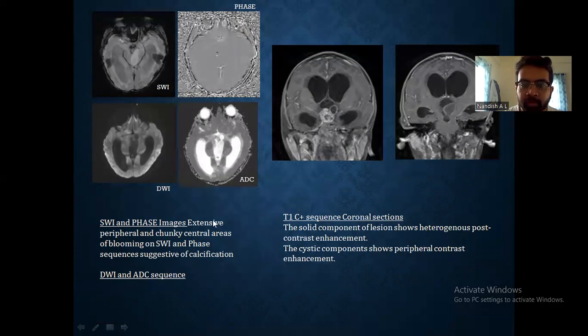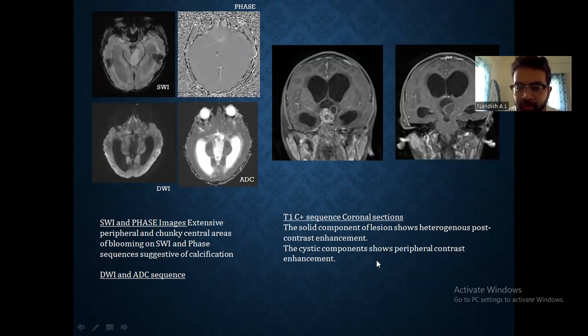Coming to the post-contrast section: the solid component shows heterogeneous post-contrast enhancement, whereas the cystic component shows peripheral contrast enhancement.